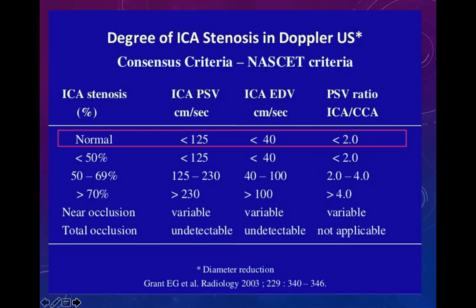You really need to get all this detail in depth, not only one side of the carotid, you also need to see the other side, compare it and see where it is. Dr. Shahu didn't go into the detail of the vertebral and subclavian. Those also come into play for carotid disease. So you really need to develop your own standards, but make sure you encompass all these arteries, particularly for the carotids.